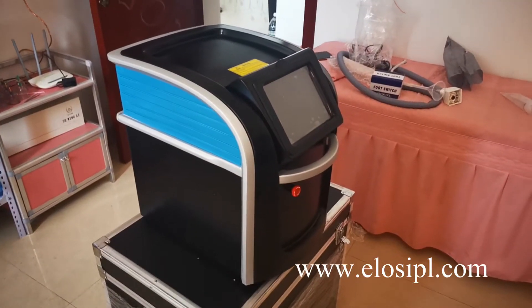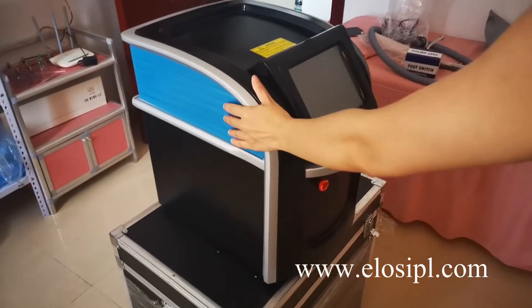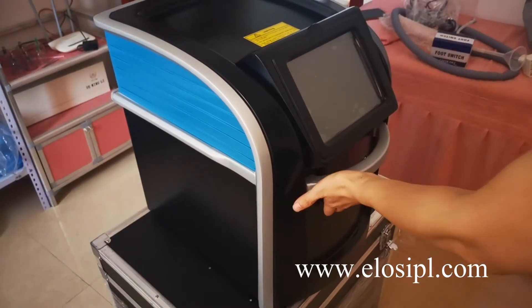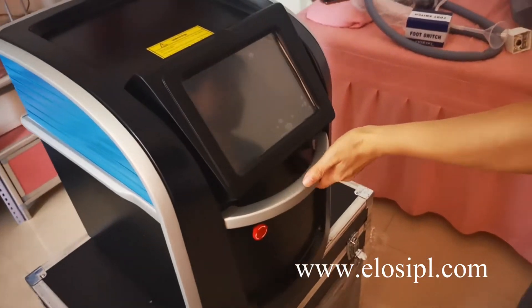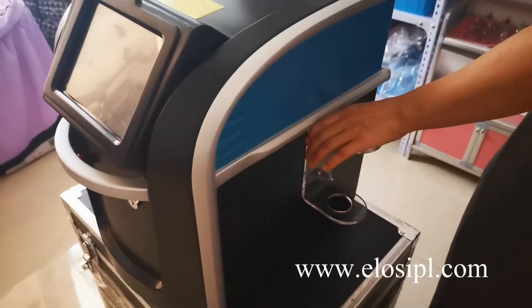Take out the machine and all accessories from the package. The front of the machine includes: the screen, emergency button, operation case, and handle holder.